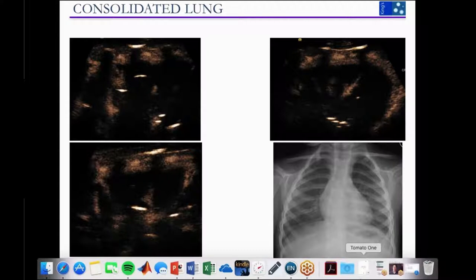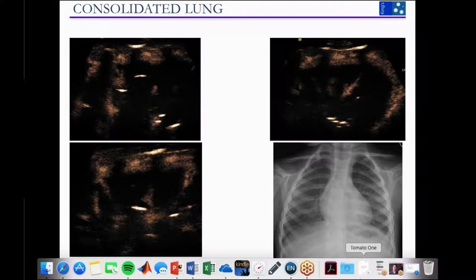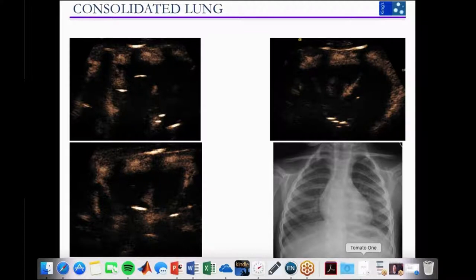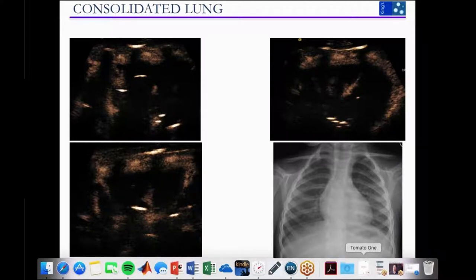IV contrast was administered intravenously — not through the drain. Although the lung was densely necrotic with black areas, there was opacification of lung parenchyma all the way to the periphery of the lung. We were therefore confident this was just necrotic lung with no underlying effusion — the drain was not draining because there was nothing left to drain. They removed the drain, and a couple of days later the chest X-ray demonstrated a normal, well-inflated, treated lung with residual change in the left lower lobe, and certainly no empyema.